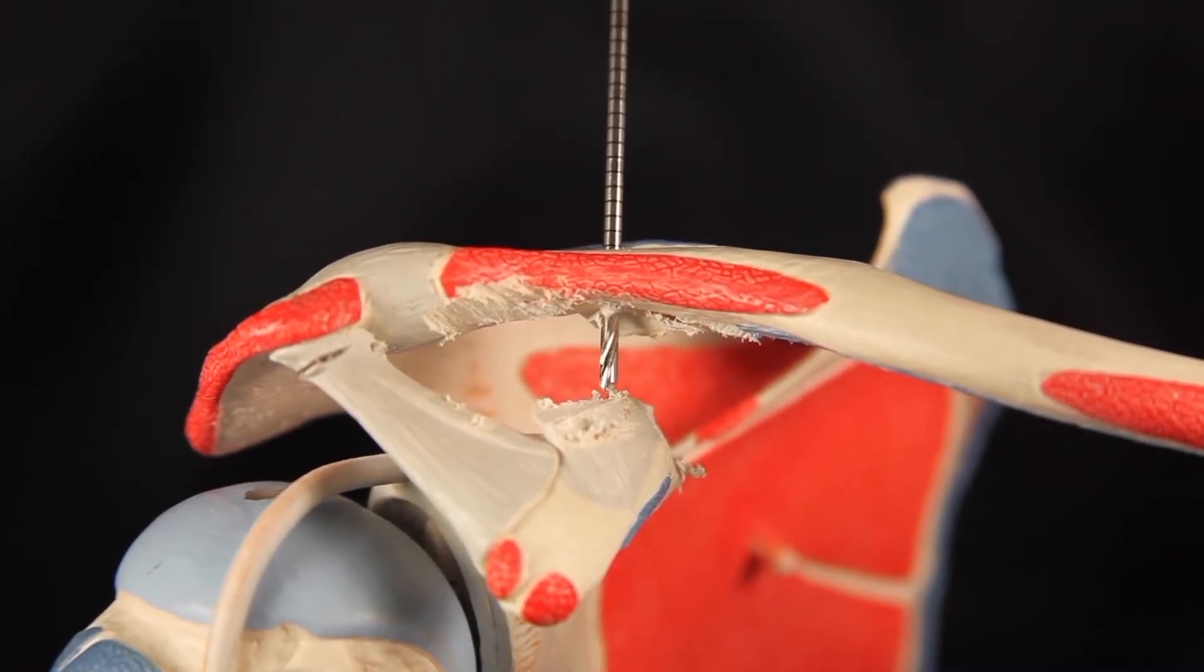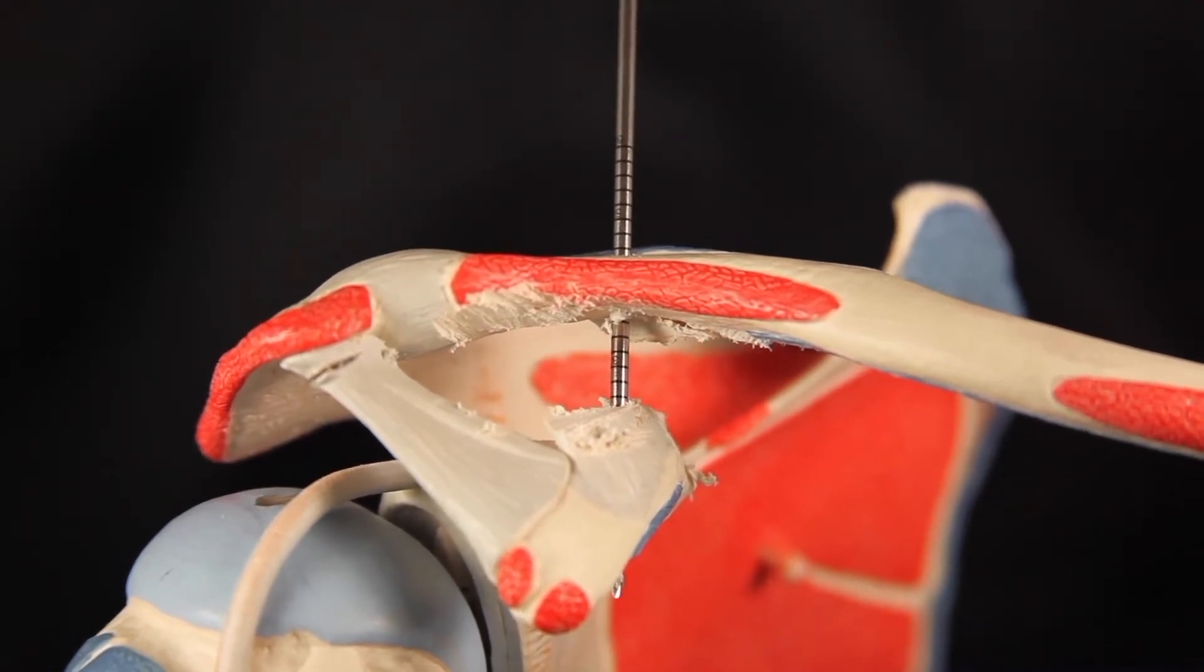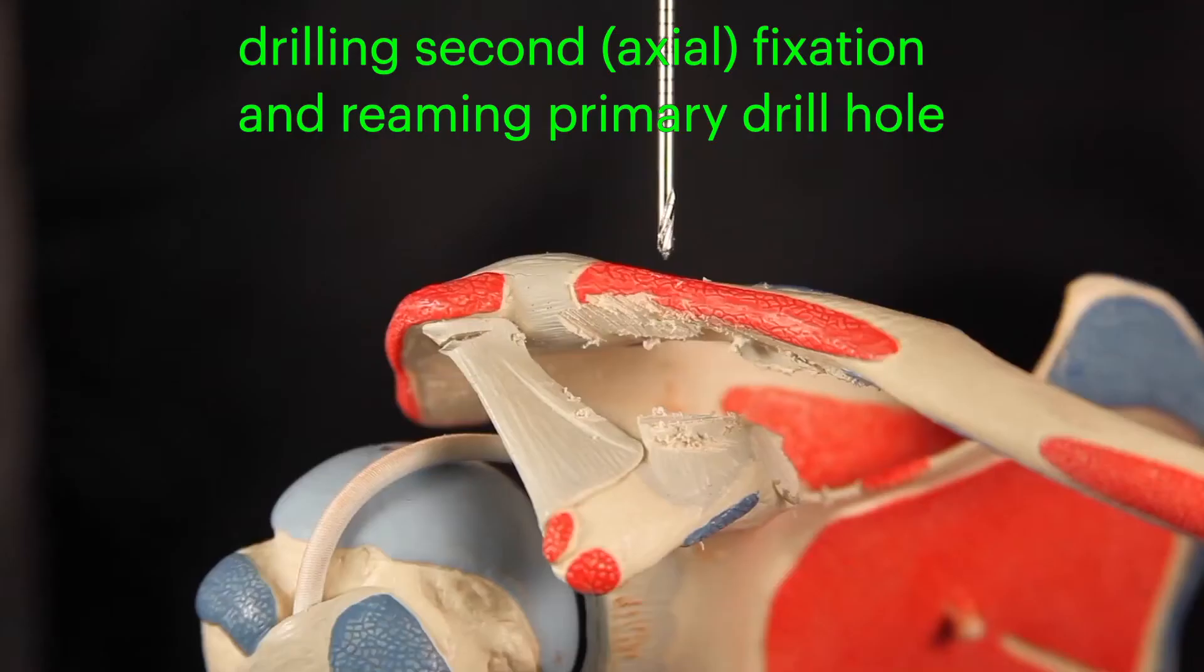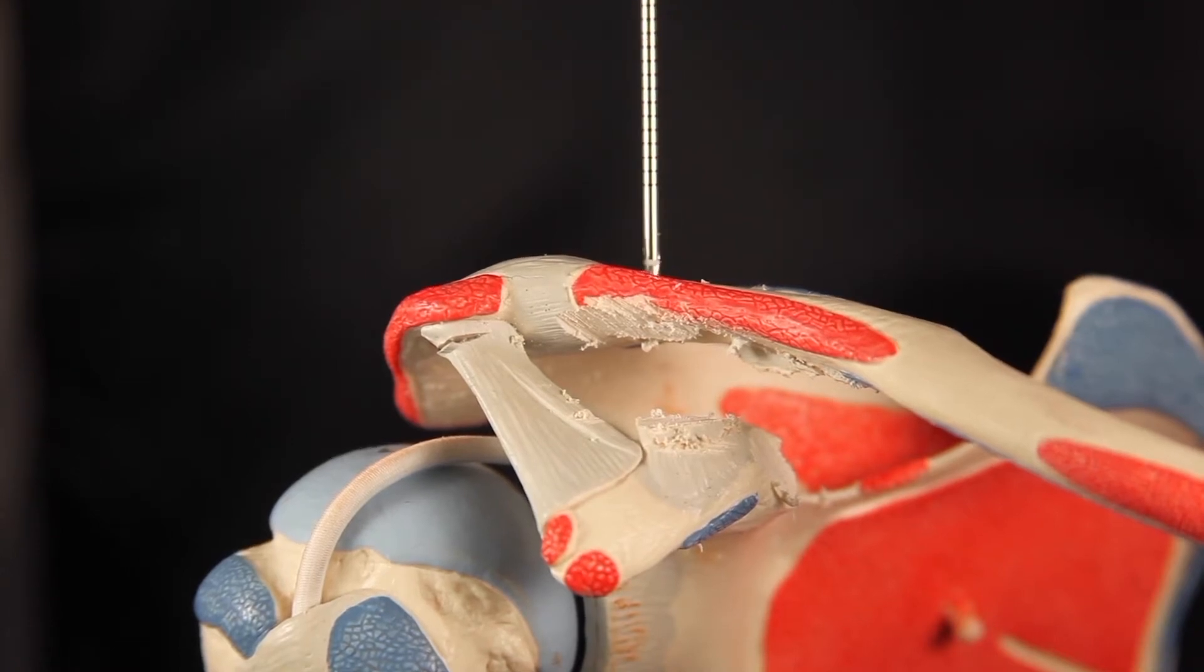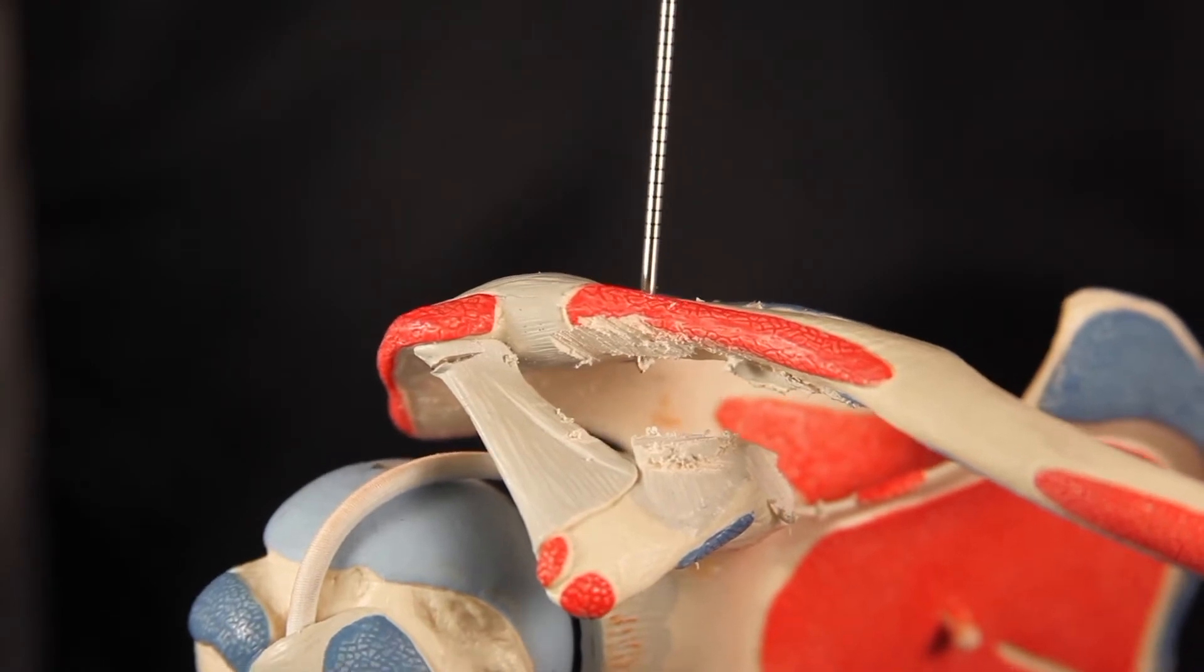It is important to make sure that the drill hole is aimed to the exact center of the coracoid under direct vision, then can be drilled through the coracoid. A second 2.4 millimeter drill hole is made approximately 15 millimeters lateral to the initial drill hole for placement of the axial fixation. This drill hole only goes through the clavicle.